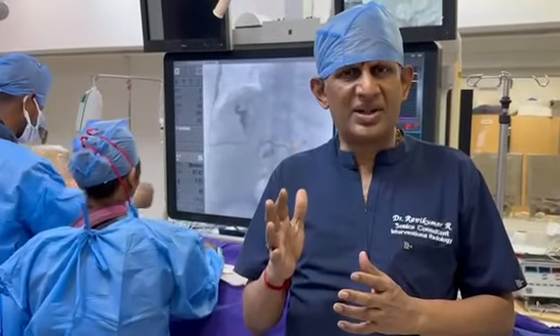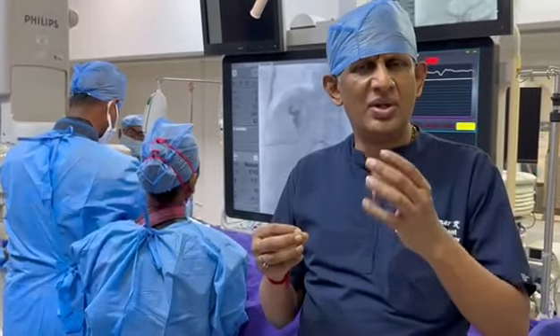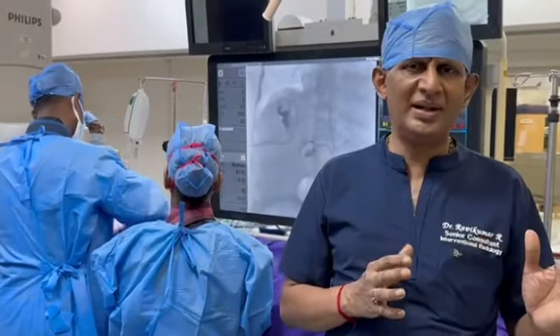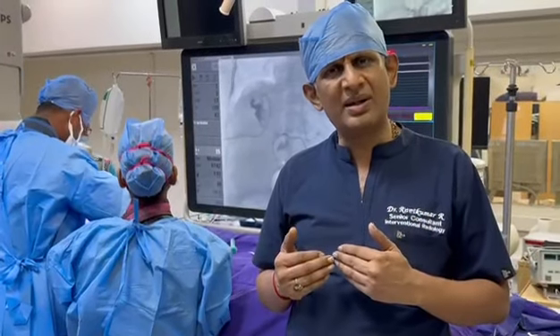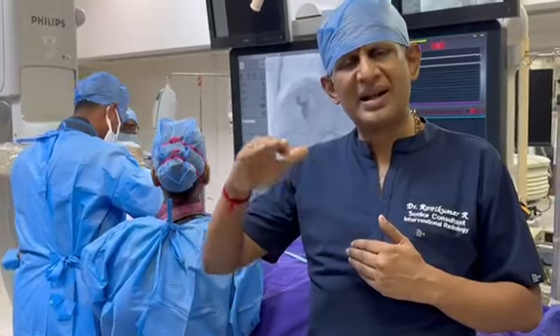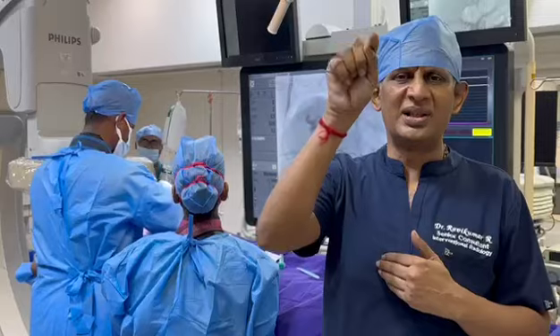For the left ductal system, ultrasound guided is absolutely necessary and important. The main reason being sometimes the left lobe is atrophied, and instead of taking multiple punctures and creating complications, use an ultrasound to go directly into the left ductal system. For the right, you can do fluoro guided or ultrasound guided, but please take caution that when you're doing ultrasound guided procedures, we generally tend to go to the segment 6 duct, and 30% of the people have the segment 6 duct draining into the left ductal system. That anatomy you need to know prior to the procedure. That means you have to not choose that and choose the right anterior ductal system.